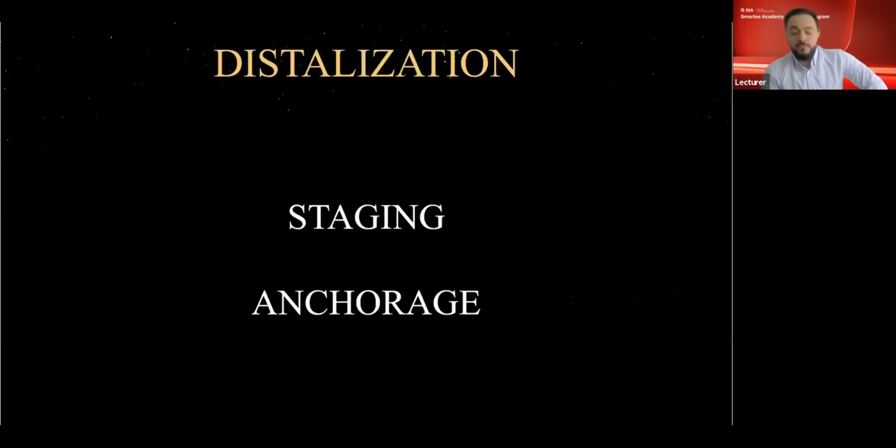So the most important factors to consider during the distalization process are how we stage this distalization movement and how to reinforce our anchorage while doing so. I know that this might be basic for some of you who are already doing distalization, but I need to go through them briefly.